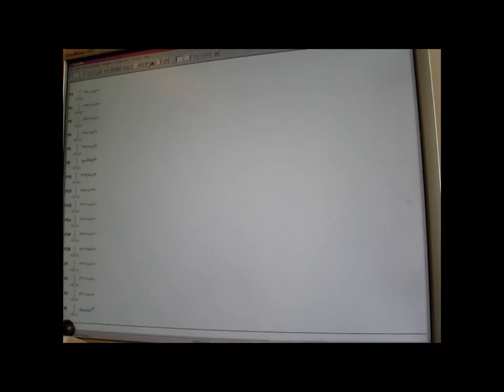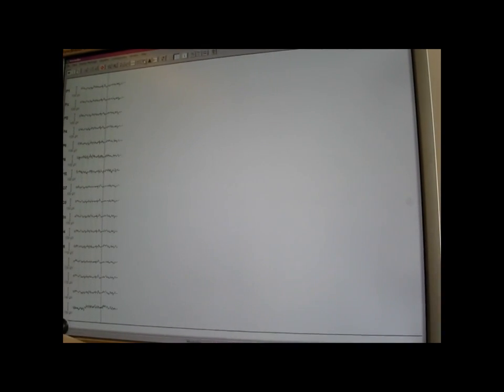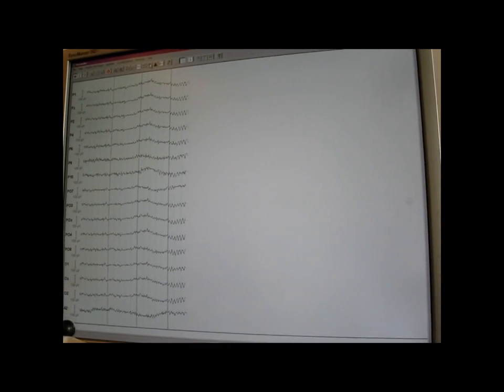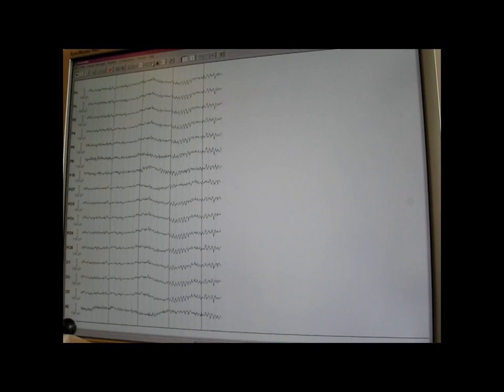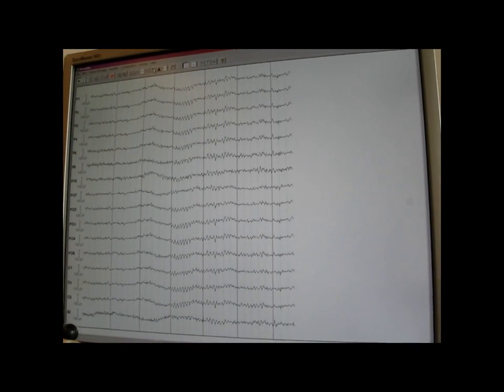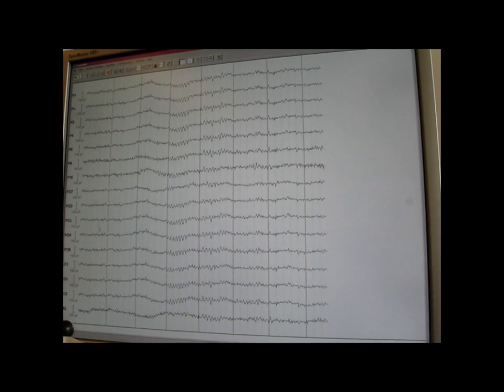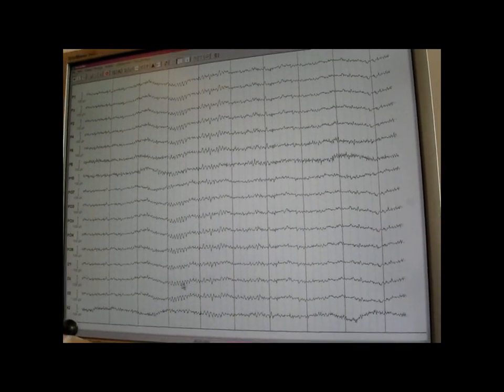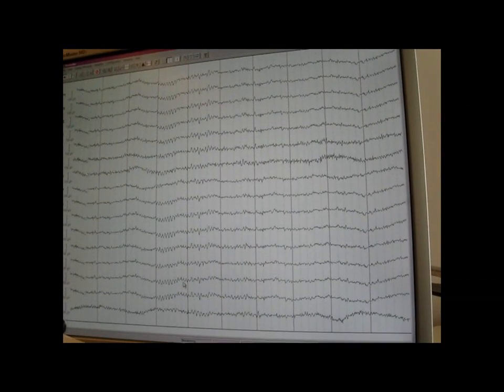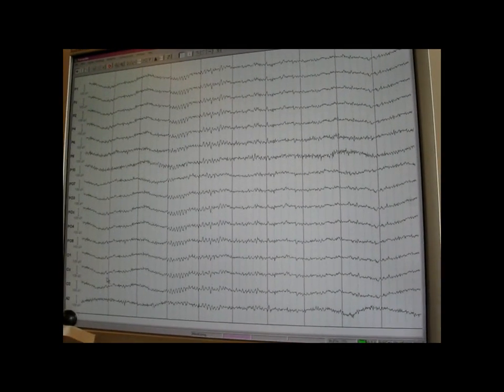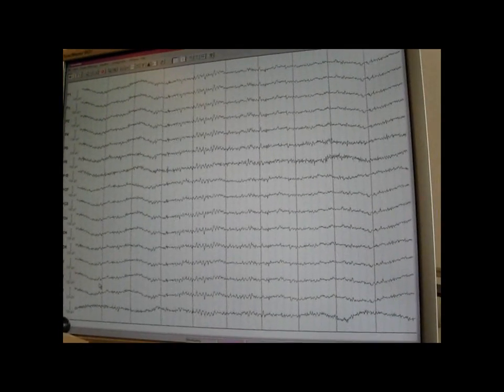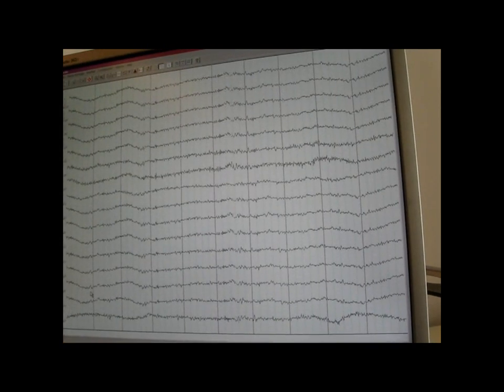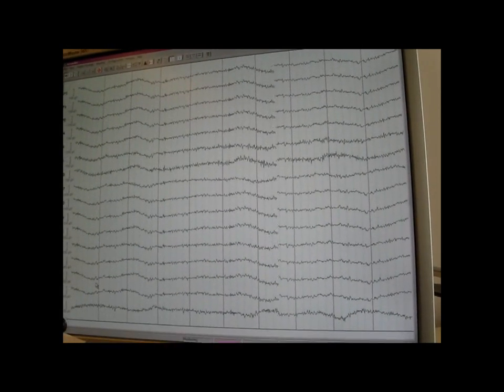Now we're zooming in and you can see something fascinating. This is beta activity and you see these larger spikes there which are more apart. That is actual alpha activity from the occipital lobe because I was closing my eyes for a second and you can see the computer notices it immediately.